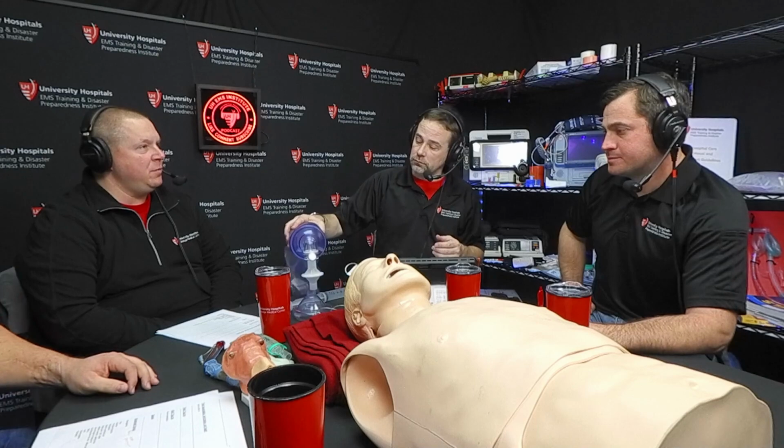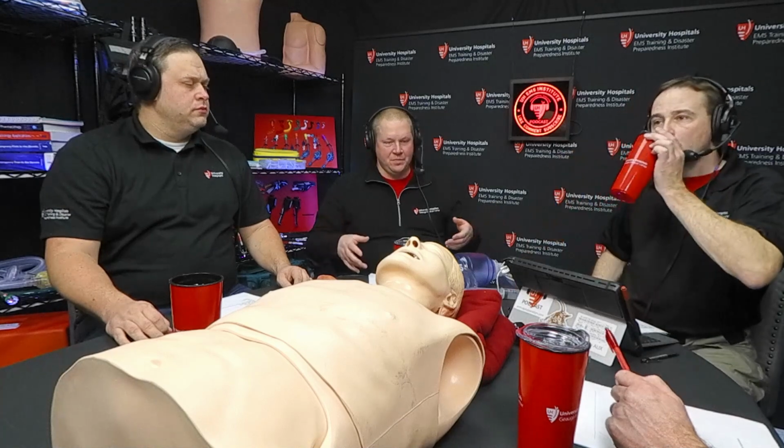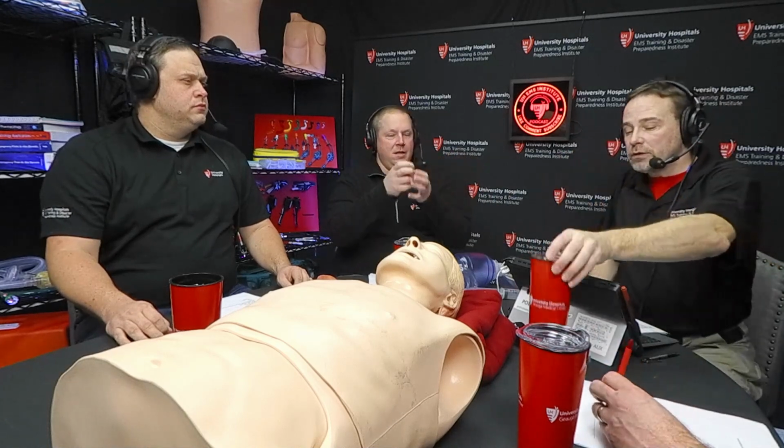I don't think people have a visualization of the PEEP. We talk about it with CPAP: this is what positive end-expiratory pressure is. We talk about it with a BVM. A great example is an airway class where they used CPVC or PVC, zip-tied pig lungs to it, and showed you a BVM with PEEP, then switched and showed you a BVM without it. That gives people the visualization of the alveoli staying open. You see the retention of the positive end-expiratory pressure in the lungs, so you are ventilating your patient better. But I think it's hard to just visualize it sometimes.